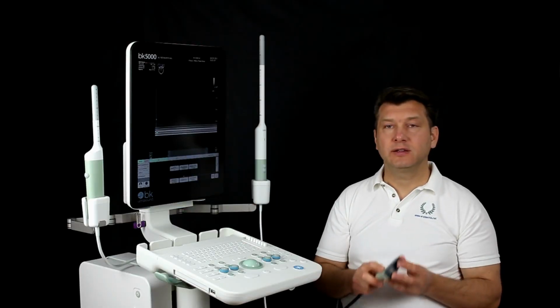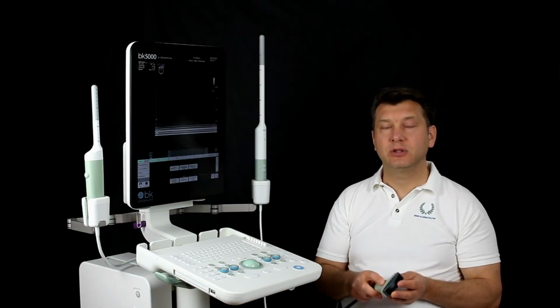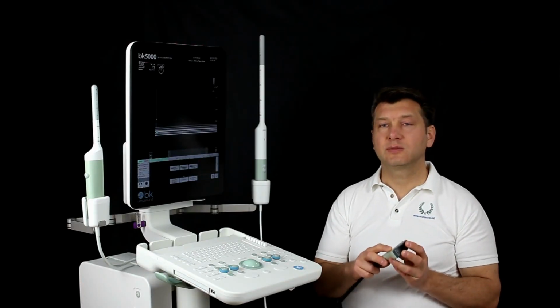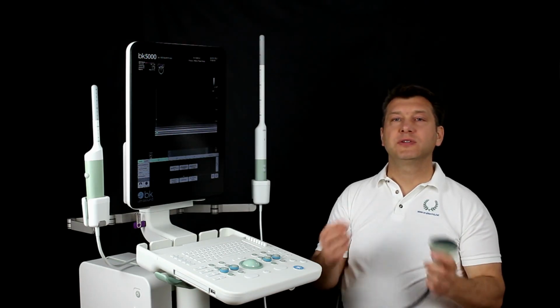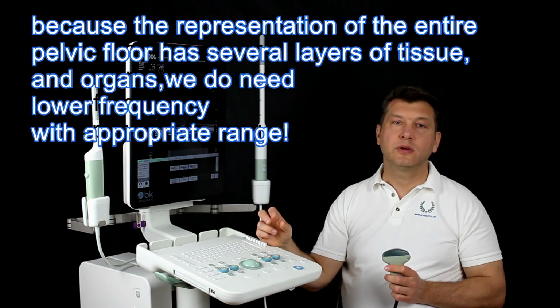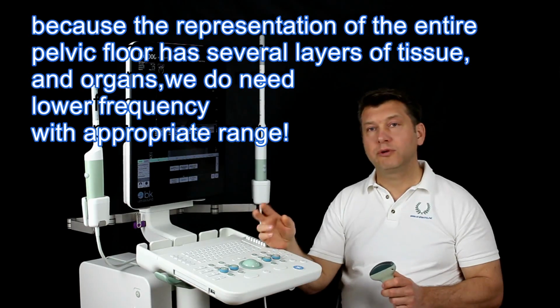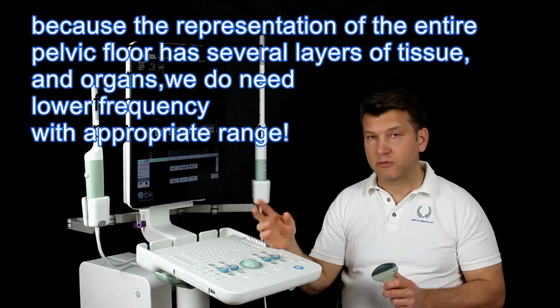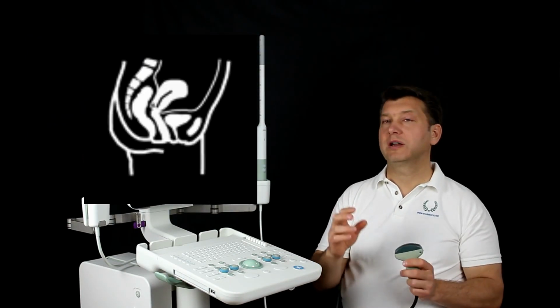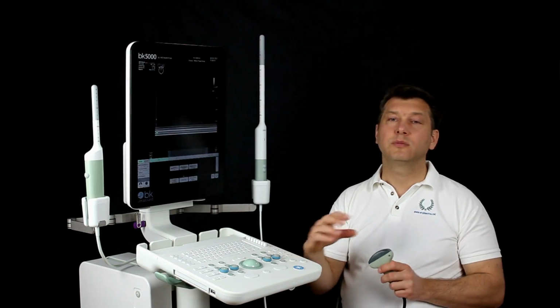To better understand these parameters, we go through them individually. Frequency 6 MHz. Because the representation of the entire pelvic floor has several layers of tissue and organs, we need a low frequency with appropriate range. This allows us to display correctly any structures, for example the bladder, which are far away from the transducer.